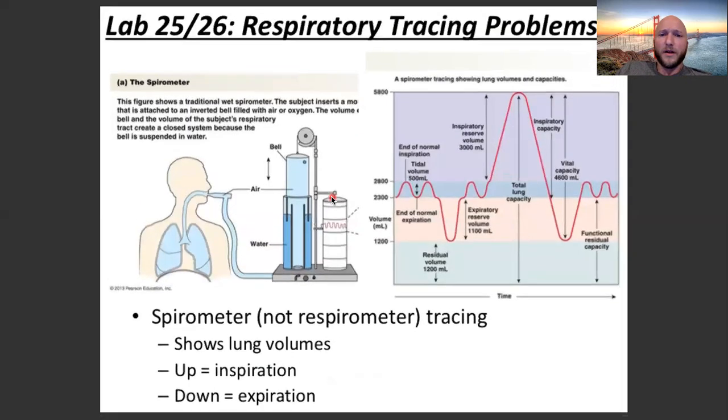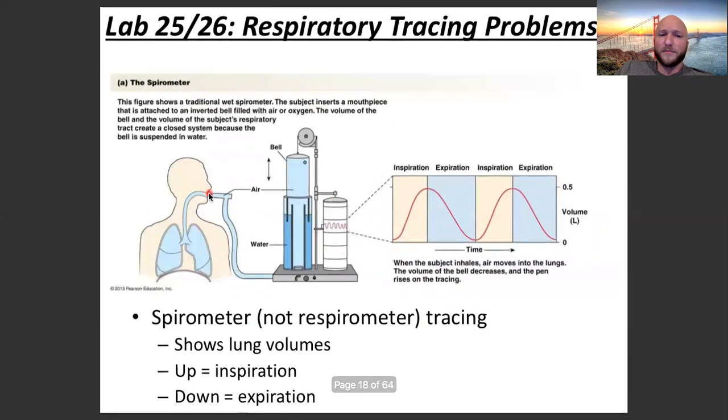What this does is it's going to be like what we did in the past, but we're going to be able to measure inhalation and exhalation over time with this. So you're going to see some similarities, but there's a few extra little bells and whistles added on to allow us to do inspiration and expiration and measure it over time.